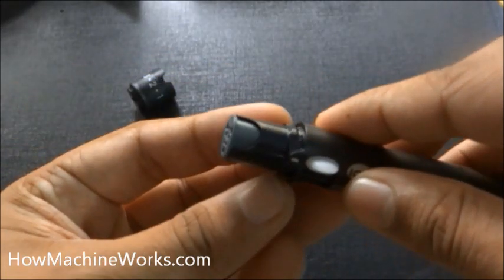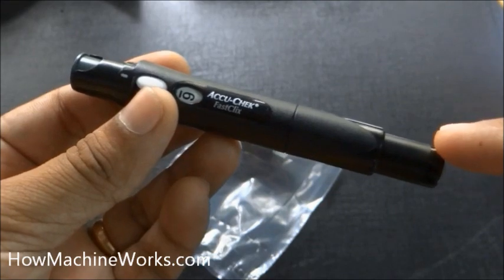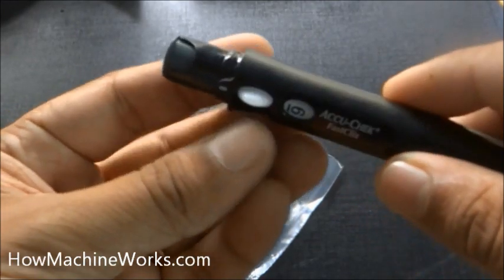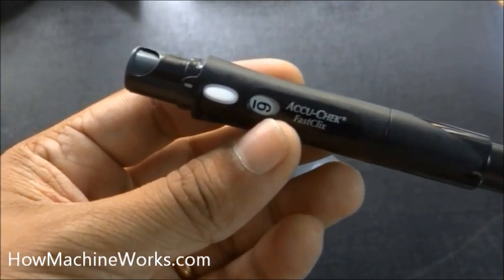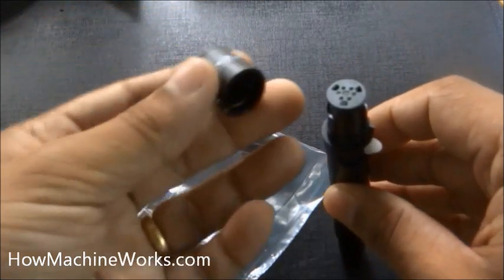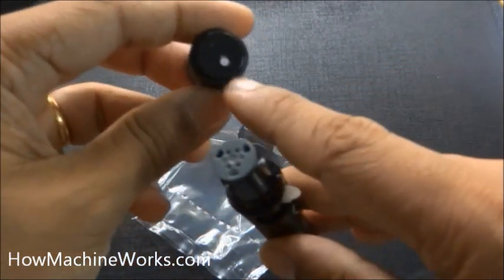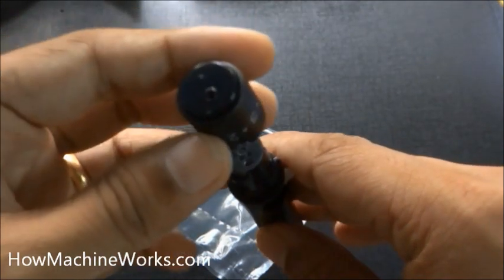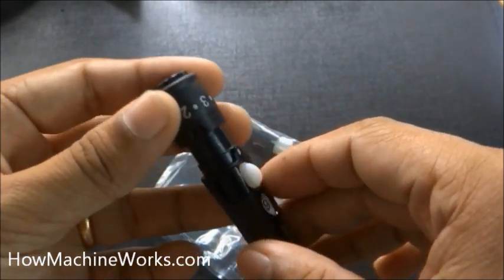Once you have inserted it, don't press the release button, so that the lancet doesn't get released and hurt your finger. Never do that. Once done, only after using all six lancets are you supposed to remove it. You can see the number six — that shows we have six lancets. After using one lancet, use that white button to proceed to the next lancet.